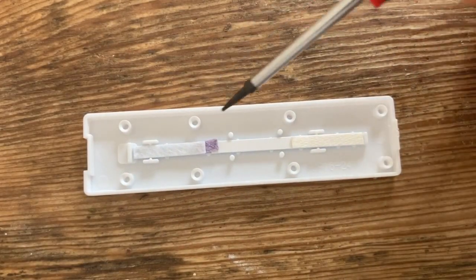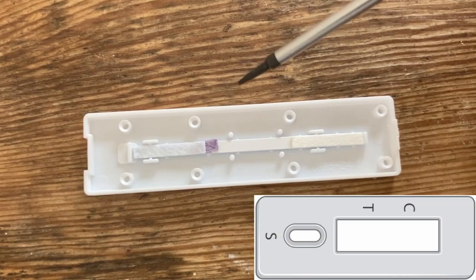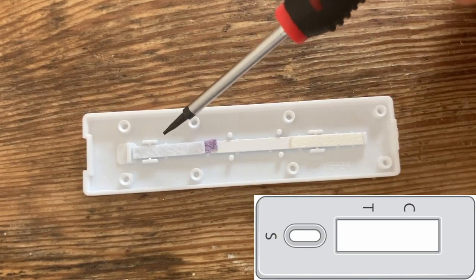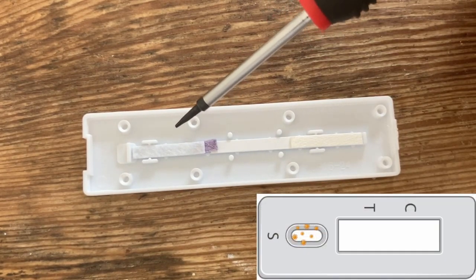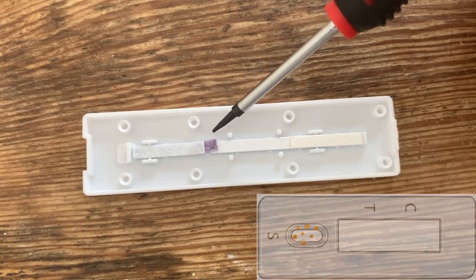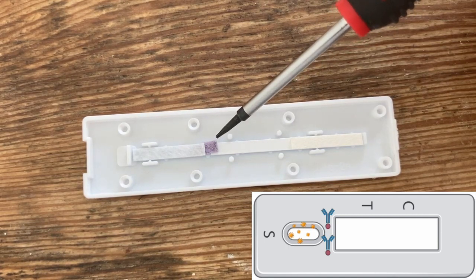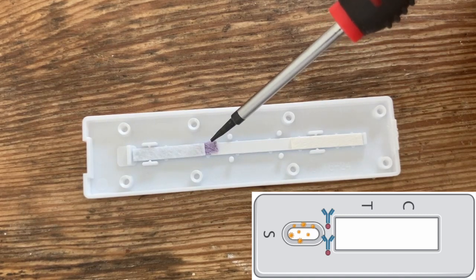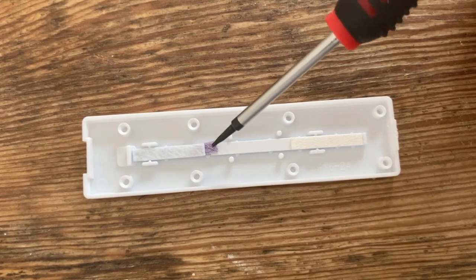All this is essentially some pads and some nitrocellulose paper-like material, and we've got four main regions. One is the sample pad, where you deposit your sample that might contain virus particles. Then we've got this red strip here — that is the conjugation pad. What we've got here is a set of antibodies that are actually attached to tiny gold particles. Tiny gold particles appear red, so that's why this pad is red.